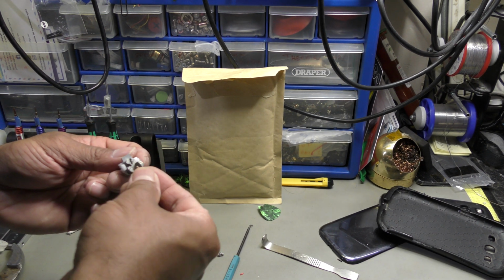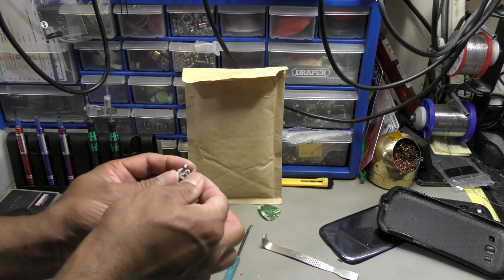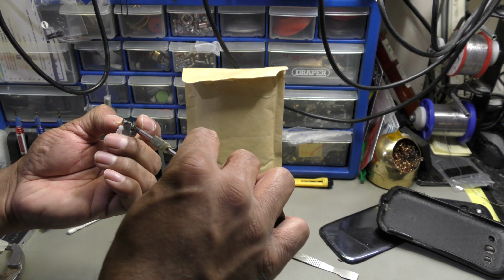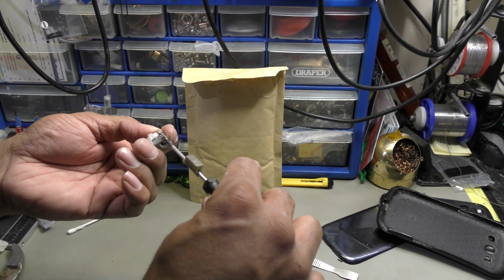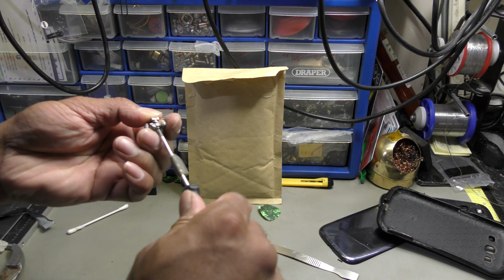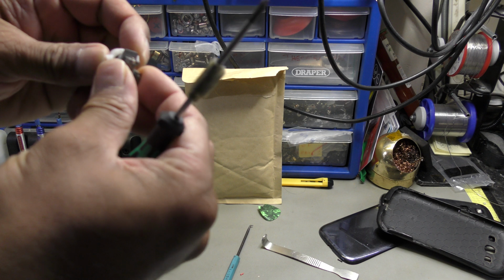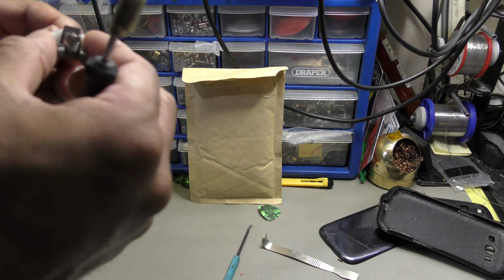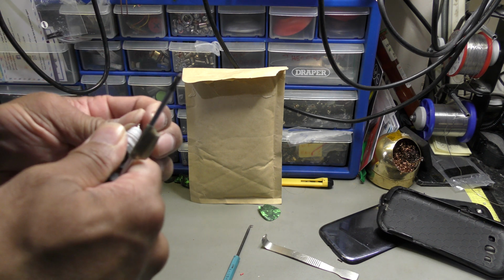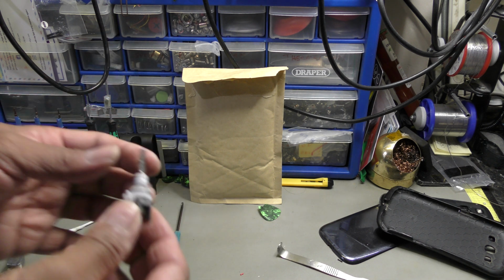So I think that's it really. I'm very pleased with the outcome, and I'm just going to keep these as spares in case I need anything out of them. I could not fully understand the root cause of the actual failure on this tip. Maybe the seal is broken, maybe there is something else that's broken. I'm just wiggling this to see what the yeah, something's gone wrong with this.